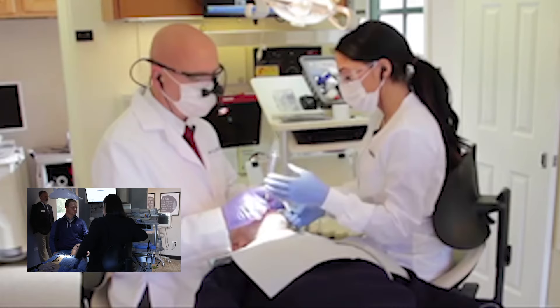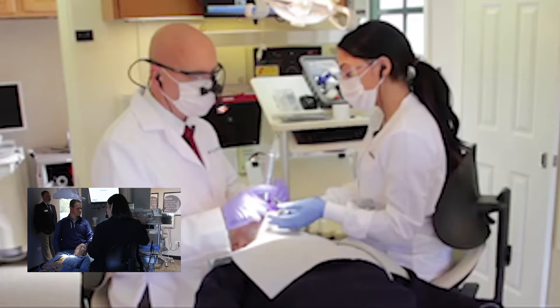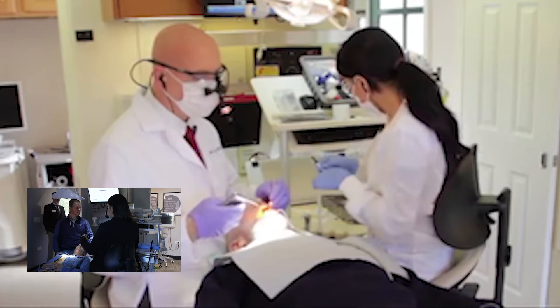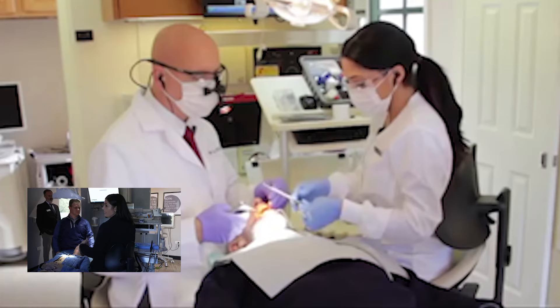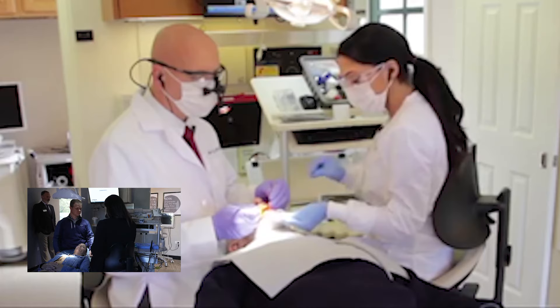When you noticed in the video with Sue Ann, she's just looking here. It's very intentional. She's got her 90%. So if anything pivots from the non-standard, she can adjust. She's closer. When she's passing, she's always making sure it's angled to the tooth that it's working on. When they're passing, they pass low. That's so the doctor doesn't need to lift their eyes up, because every time you do that, now you have to reset. We want it low.